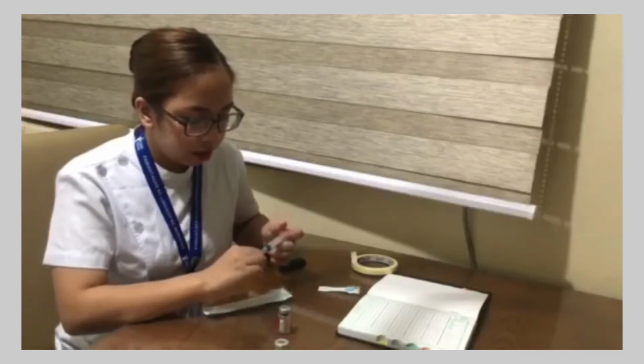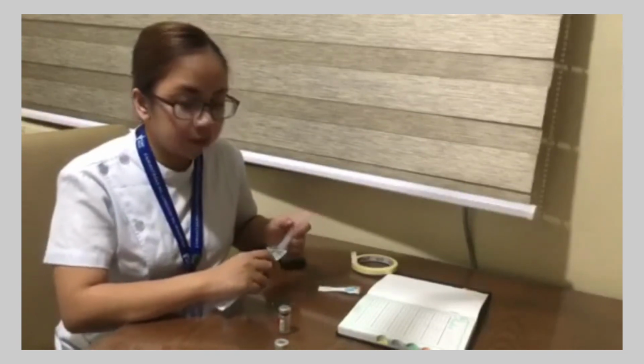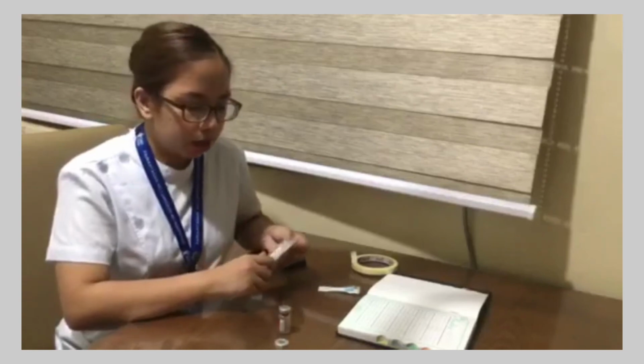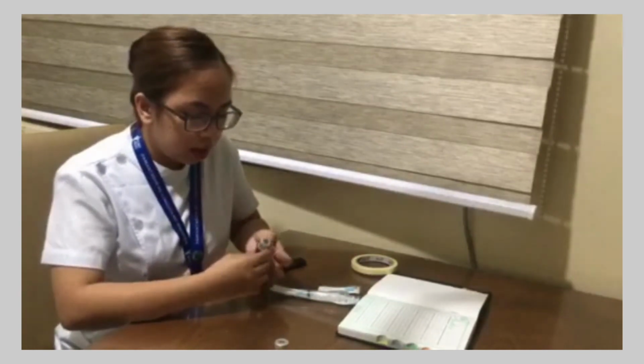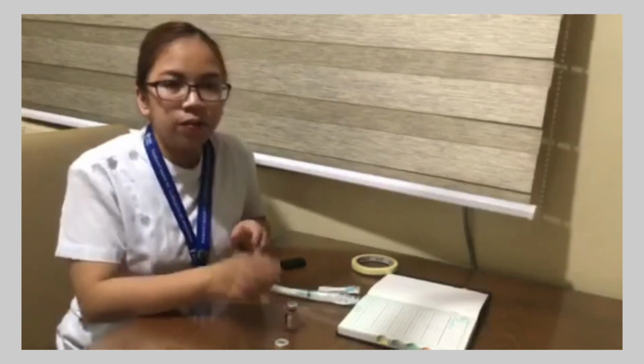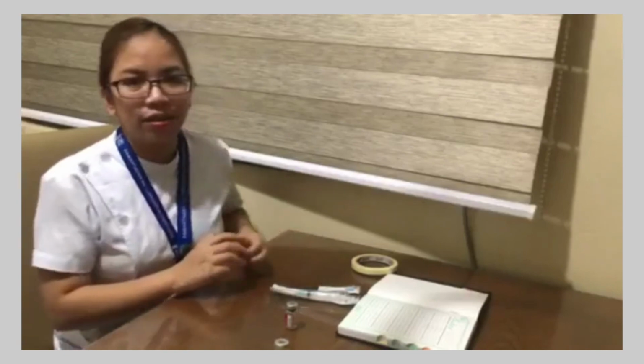If the vial is reconstituted, label it with your name or initials and the date, and place it in the refrigerator or as per the manufacturer's recommendation. After that, you have to take care of all the materials that you've used and perform hand hygiene, and last is to document your procedure. That's all. Thank you.